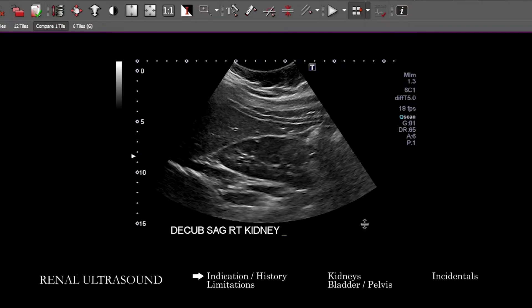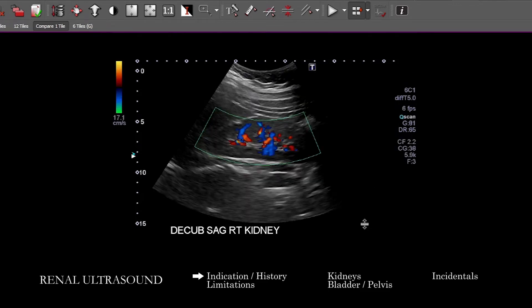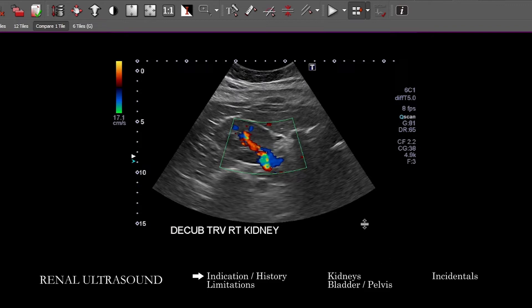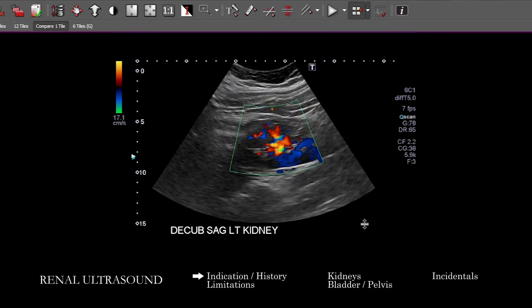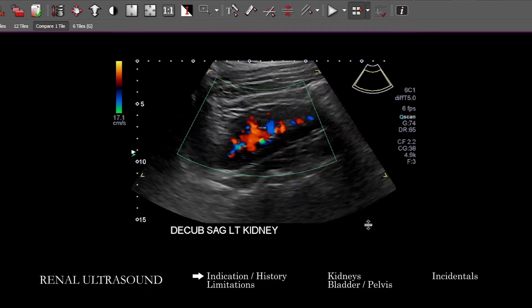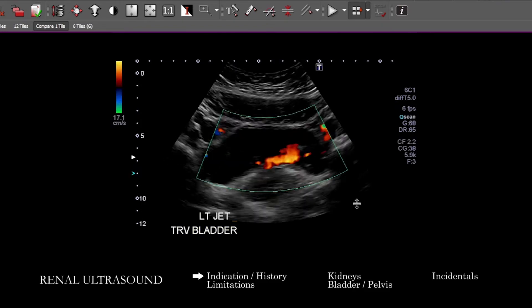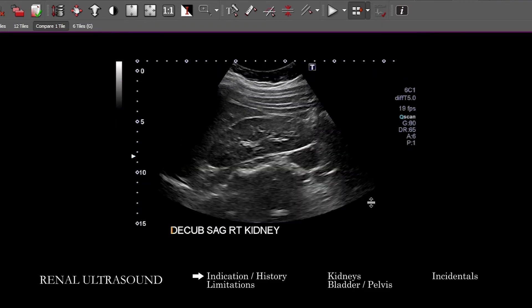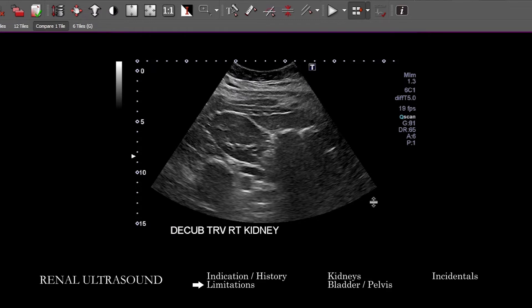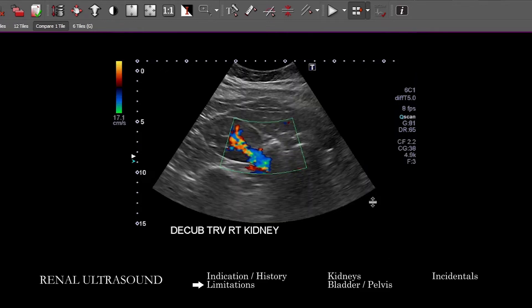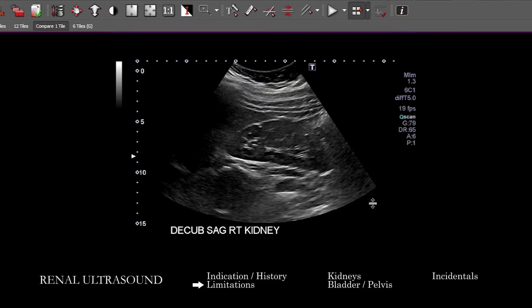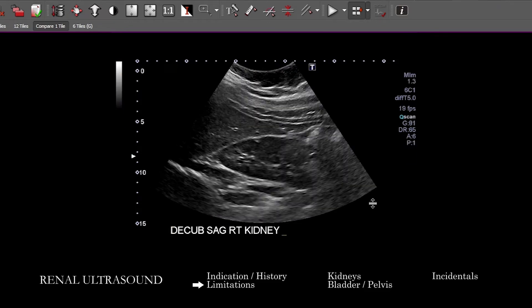We have here ultrasound images of the bilateral kidneys — the right and the left. Going down, we also have the bladder in multiple planes with color Doppler. The first thing you want to think about is: do we have multiple images of each kidney? Do we have measurements in long axis and in short axis at multiple areas? You want to see multiple planes through the bladder. If you've got a male patient, you want to make sure we're seeing the prostate.